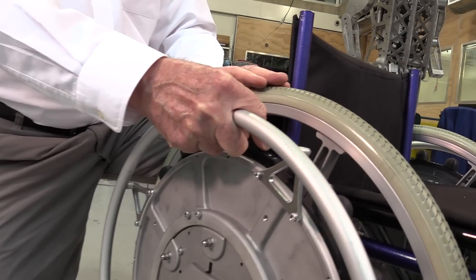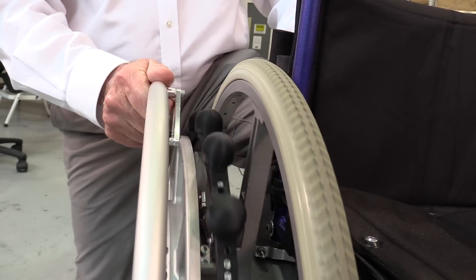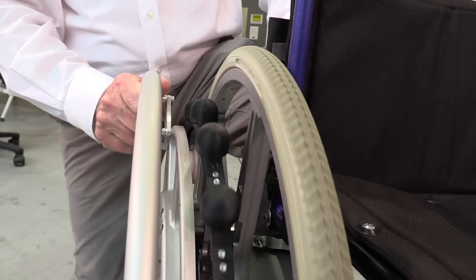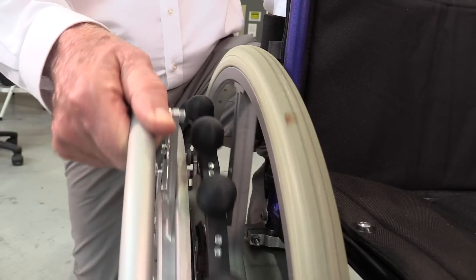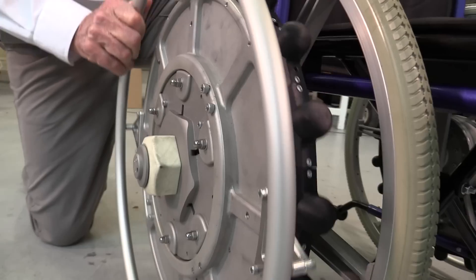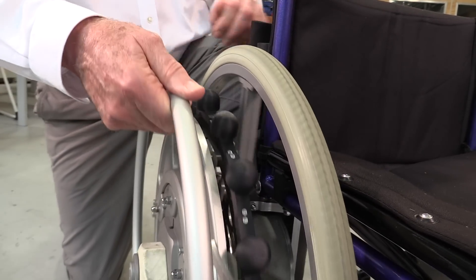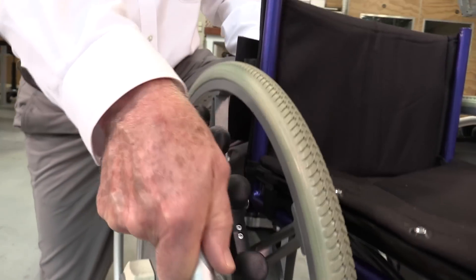If I move this back, I'm now in what we call run mode. I push it forward and the wheel goes forward. I pull it back and — miracle of miracles — the wheel goes forward. So all I have to do is pump this push rim and I go forward. If I want to go forward fast, I turn it into high gear and it goes fast, or I can put it in low gear and it goes slowly.